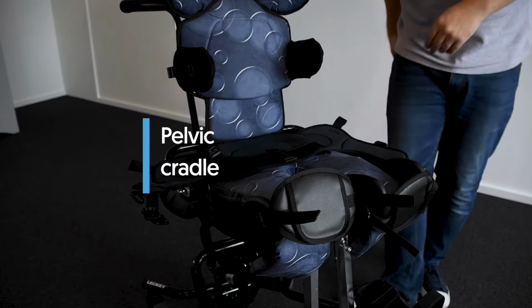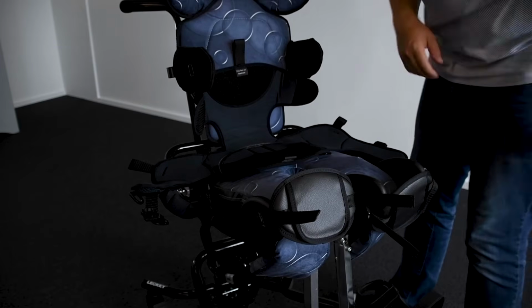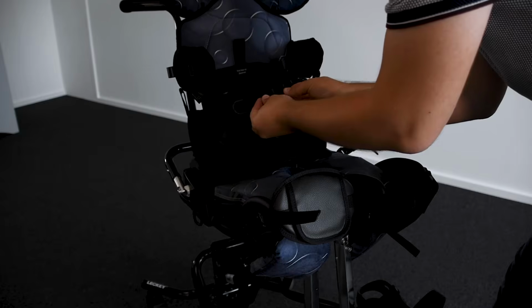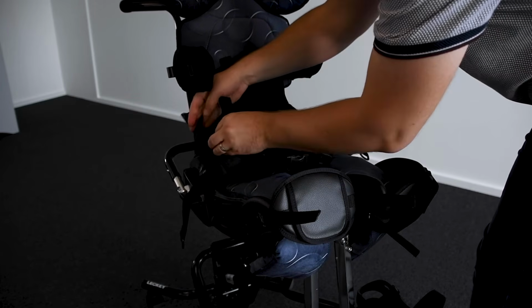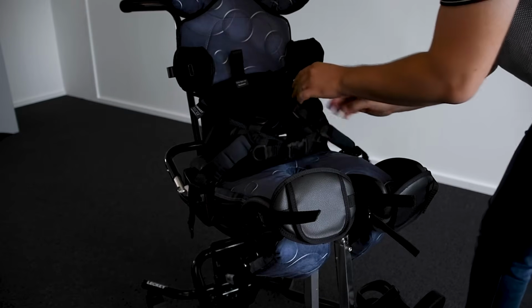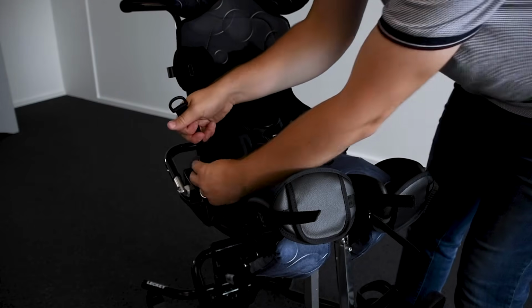Pelvic cradle. The pelvic cradle should be flat and open when the user is placed into the Mygo seating system. First, fasten the buckle at the front of the pelvic cradle. Then fasten the Velcro at the sides to fit the pelvic cradle to the user. Then adjust the front and rear straps to secure to the position of the user's pelvis.